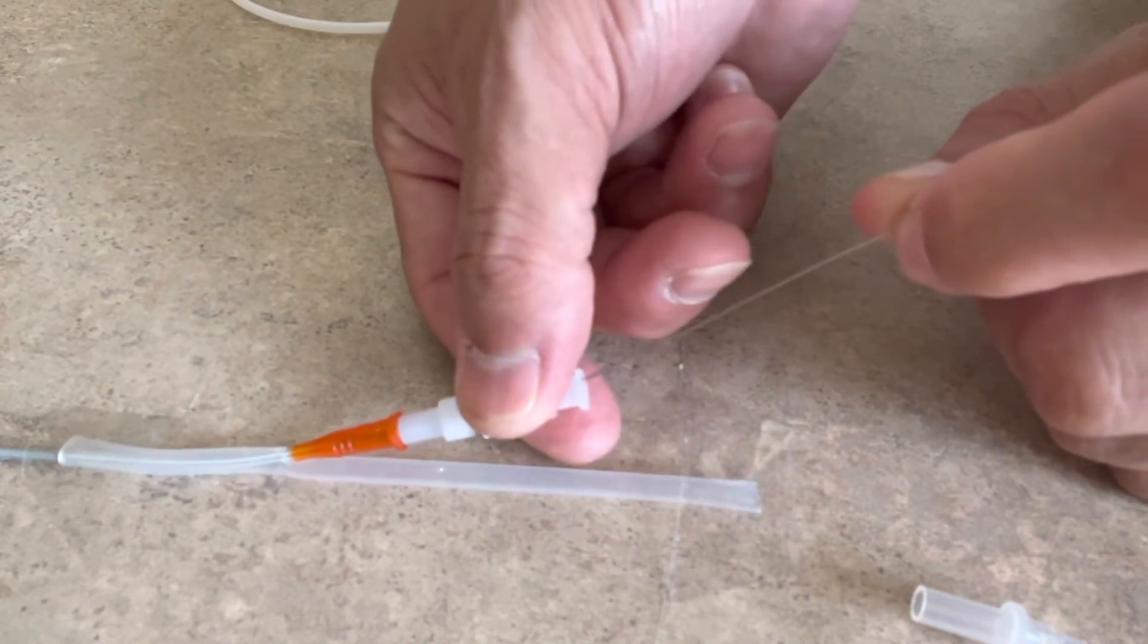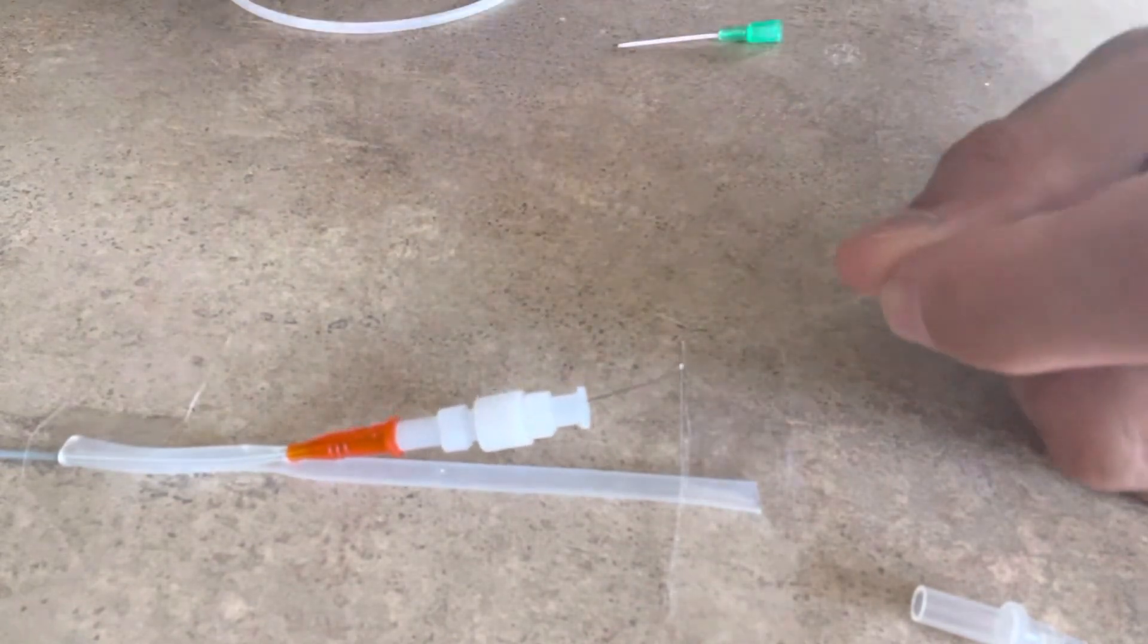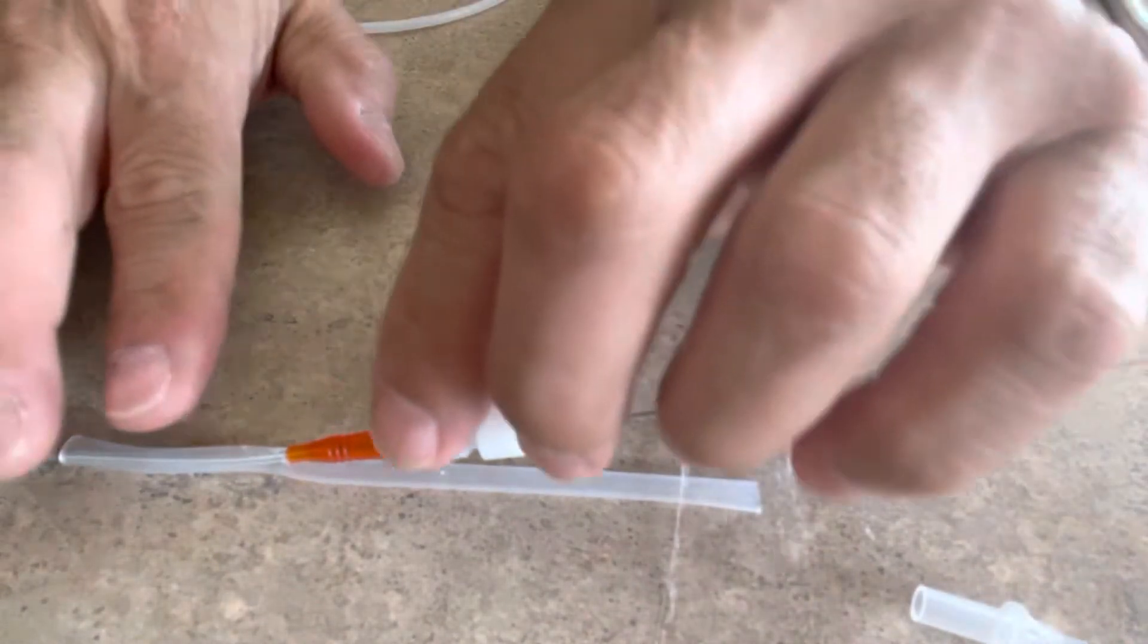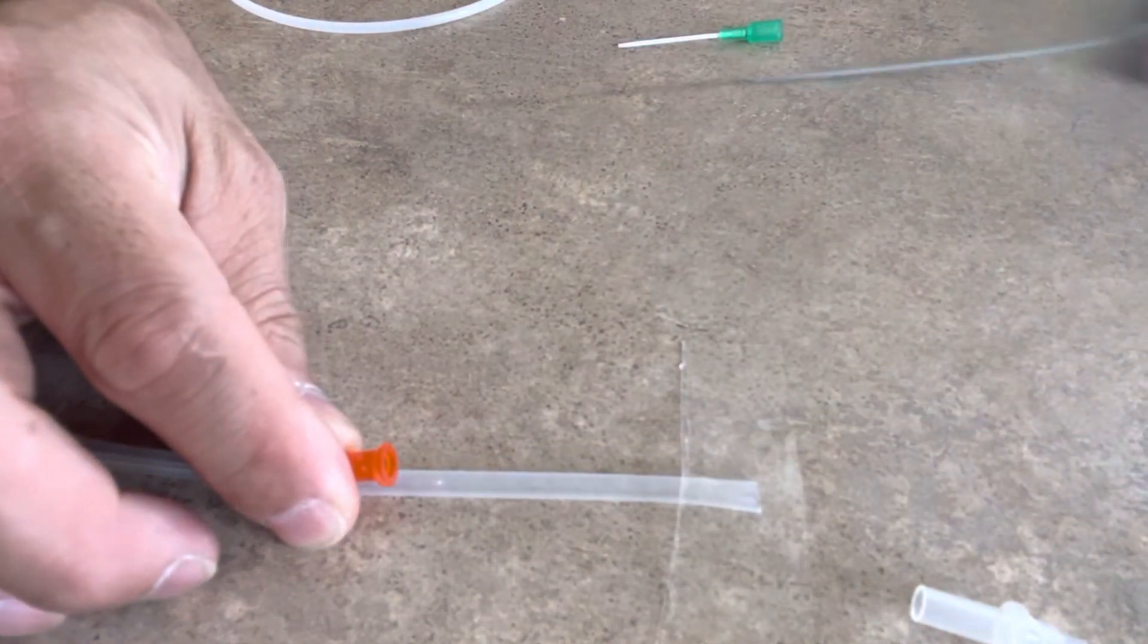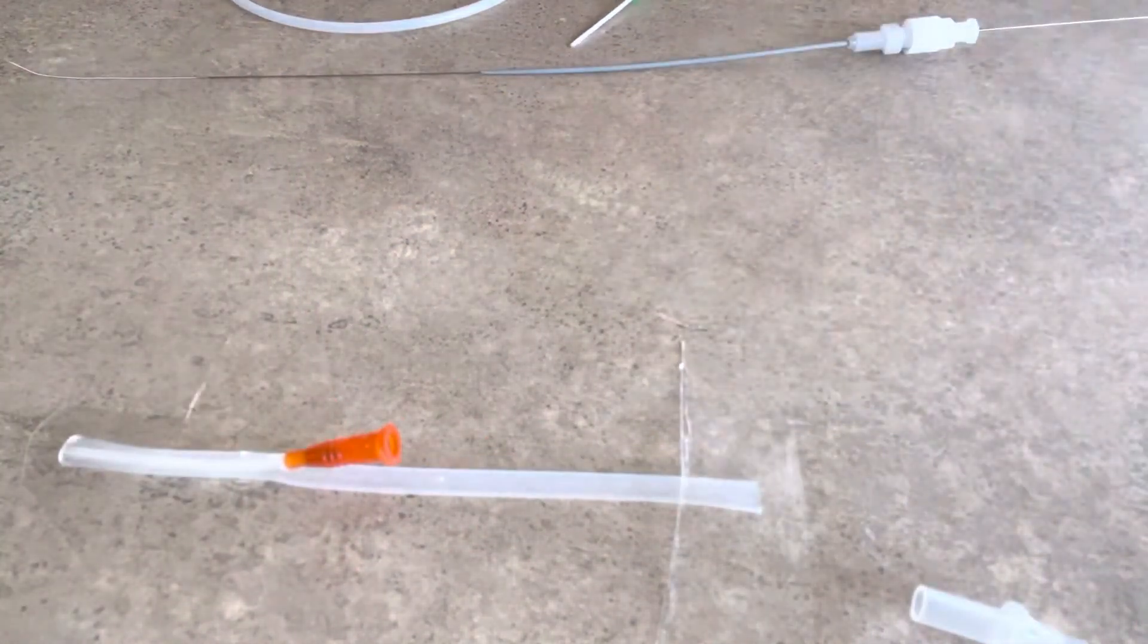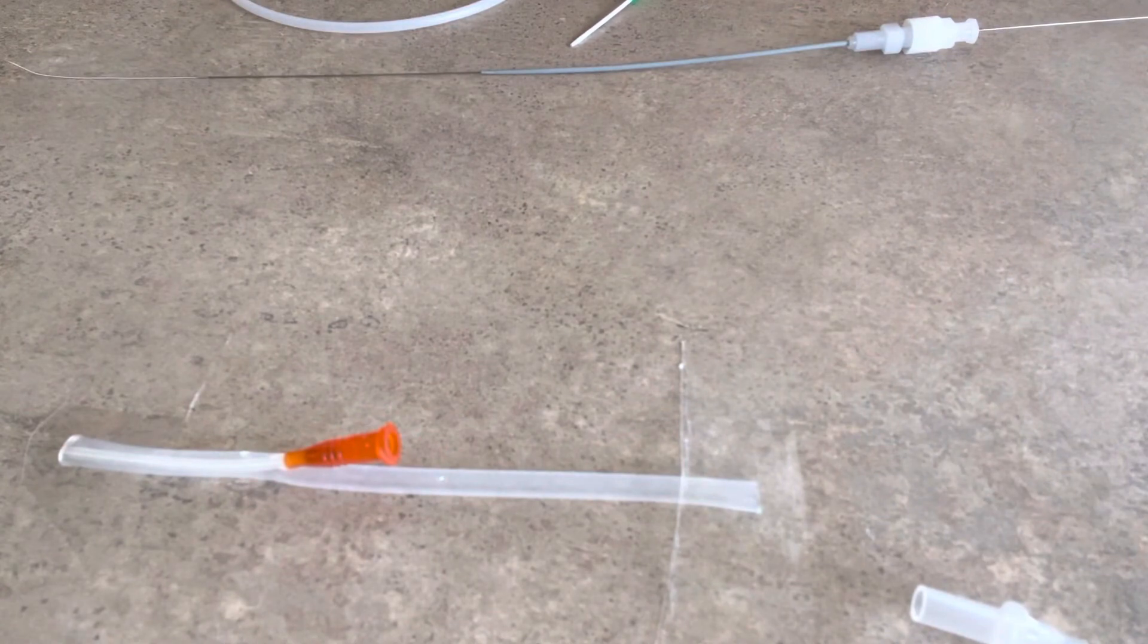Once I get there, I just advance the angiocatheter as far as it will go. After that, same old thing. I'm going to take my wire and my dilator out and now I'm left with a 14 gauge IV catheter instead of my 18 gauge peripheral IV.